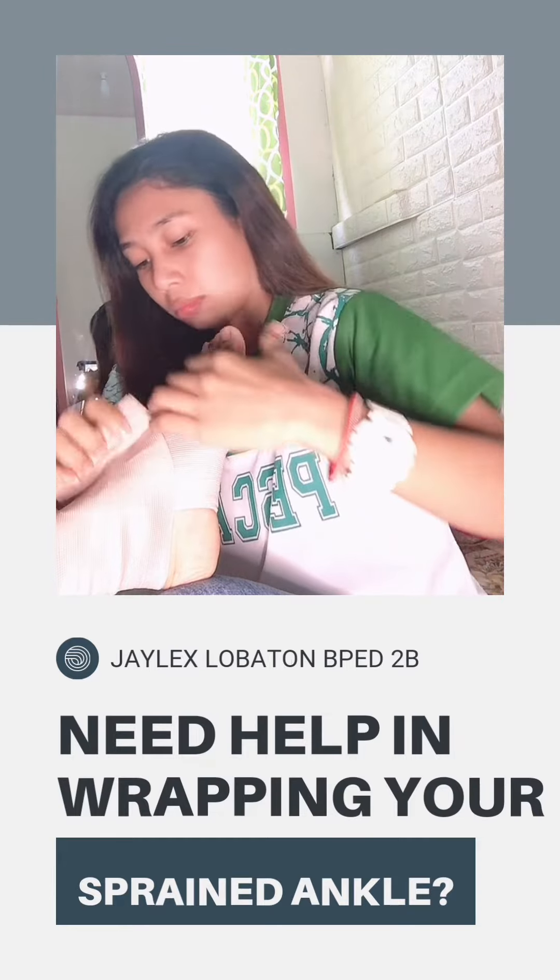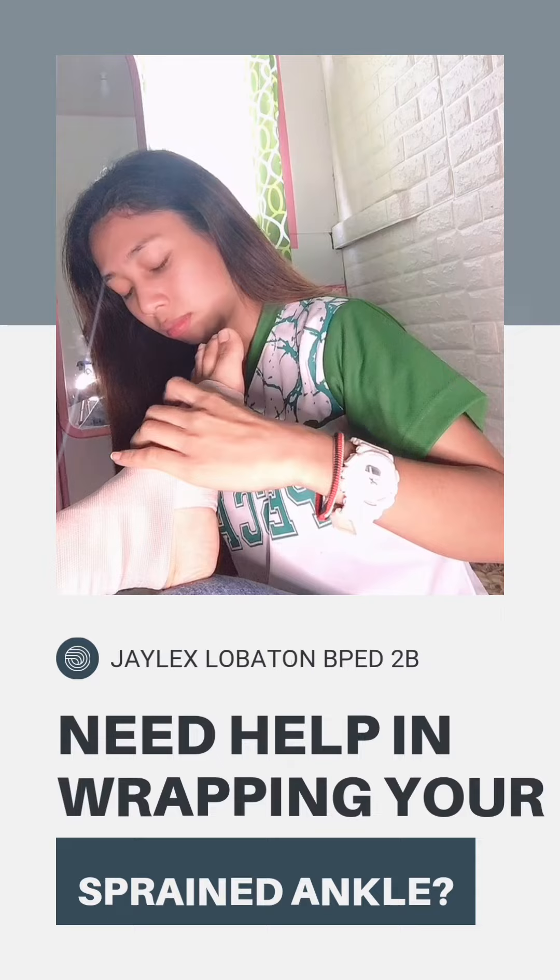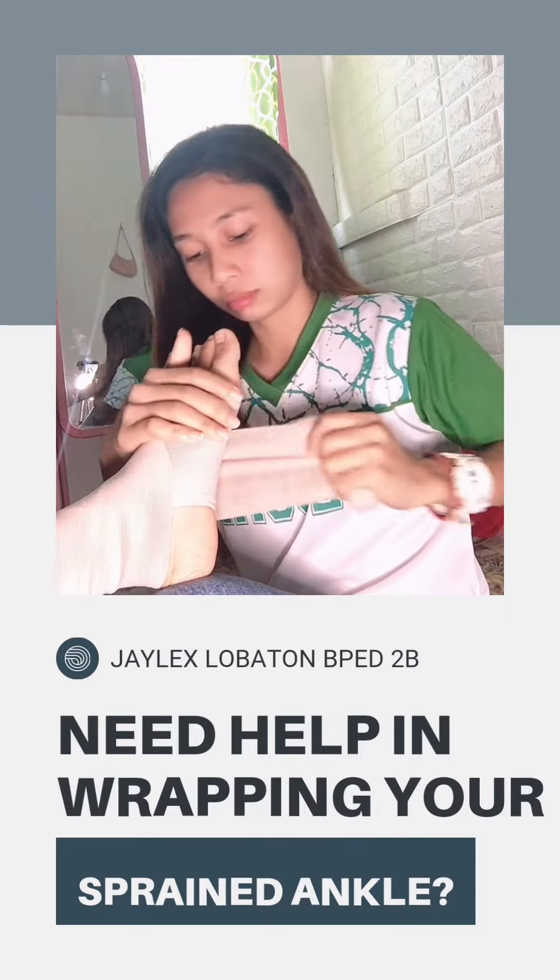When you get to the ankle bone, wrap the bandage around the felt piece so it stays in place under the ankle bone.